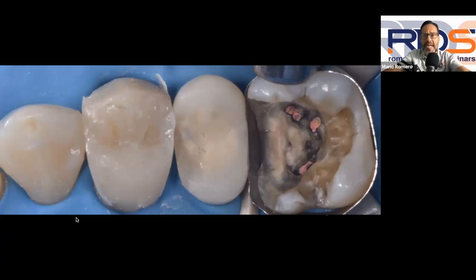And in order for you to do that, you have to understand one key element. You have to make sure that the distance between the perforation for the first molar and the perforation for the second premolar is at least 5 to 7 millimeters. You will not get away in a case like this if you have less than 5 millimeters between your perforations. And you've got to think about this. The more separation you have, 5 to 7 millimeters between these two perforations, the better. In this particular case, I've created 4 or 5 perforations, but these two are the critical ones.